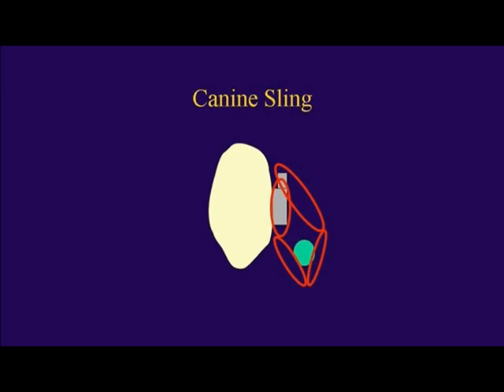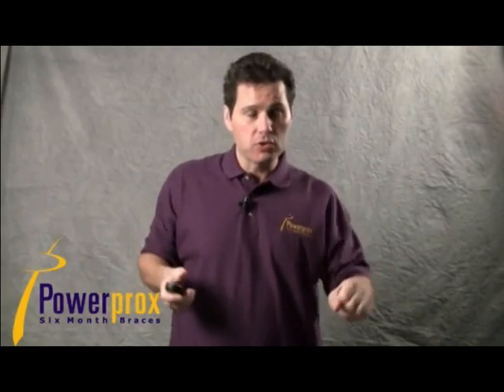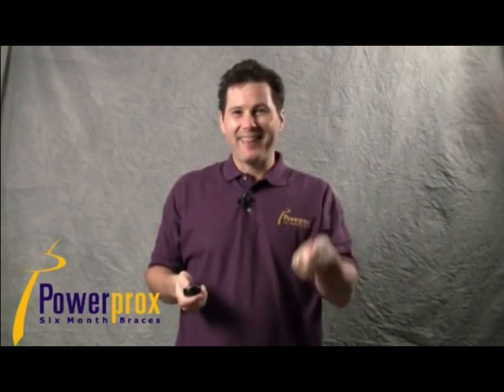So you basically have a little sling that the wire sits in, and you can see that the wire is going to be incisal to the bracket. So the nickel titanium arch wire will not be reaching way up to get that canine. It's going to be a bit lower, so that's going to help prevent unwanted side effects, unwanted movement on those adjacent teeth while still bringing that canine down.